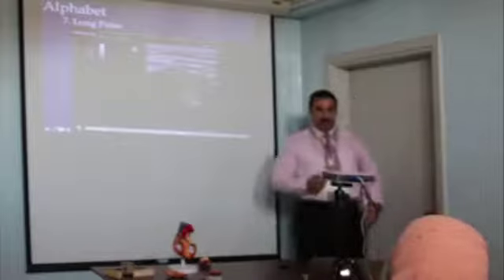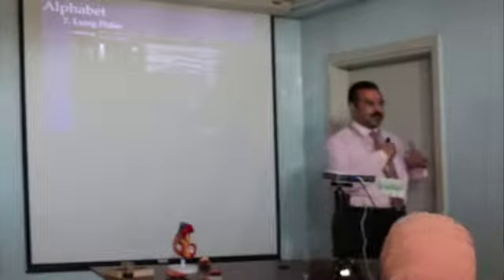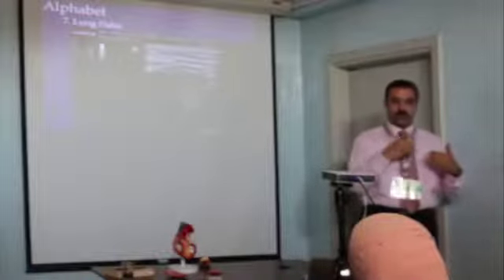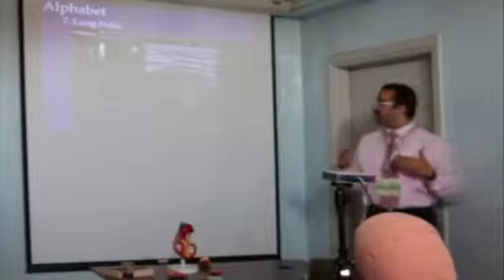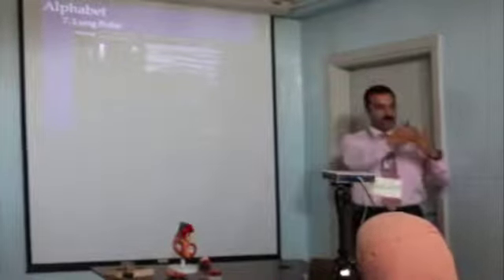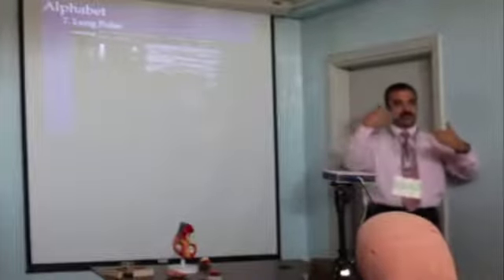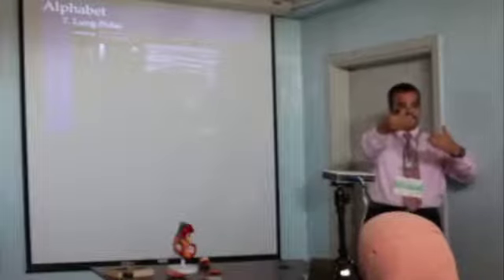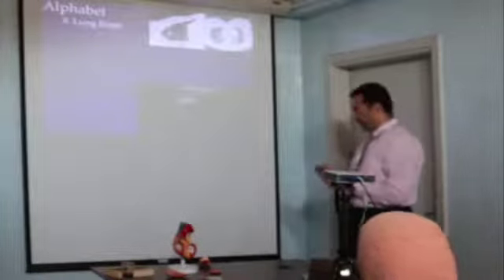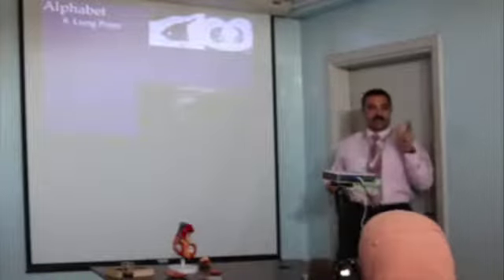Lung pulse, another indicator of normal lung. Lung pulse means cardiac pulsations are transmitted through the lung tissue. If you find this sign, it is another indicator of normal lung, because if there is air in the pleura, cardiac pulsation will not be transmitted to the ultrasound probe. So this is another sign of absence of pneumothorax. This is lung pulse.